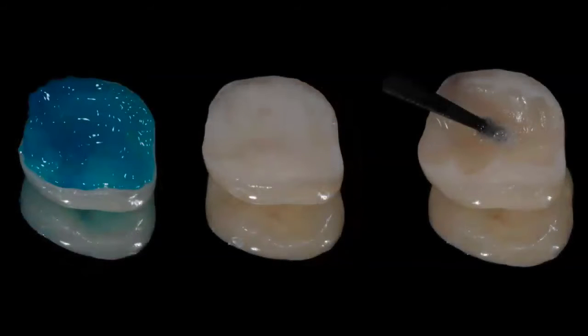Right after the hydrofluoric acid has been rinsed off and you bone dry the restoration and see that white frosted surface, we're going to use phosphoric acid. I'm going to share two critical steps here. First, you apply the phosphoric acid to the intaglio surface of the restoration and leave it there for 1 minute. One minute later, you rinse and bone dry, and that's exactly what you're seeing in the middle photo. You can see that I've been able to remove the great majority of that white precipitant that was produced.